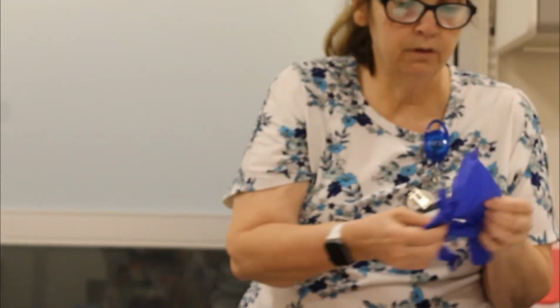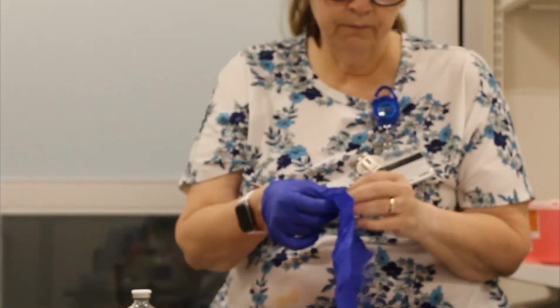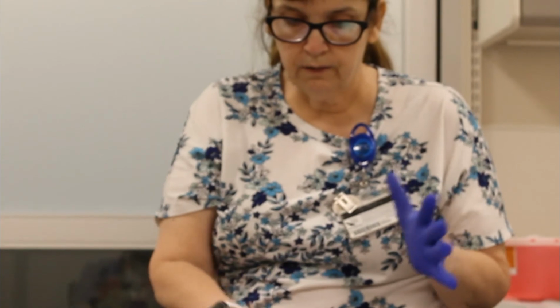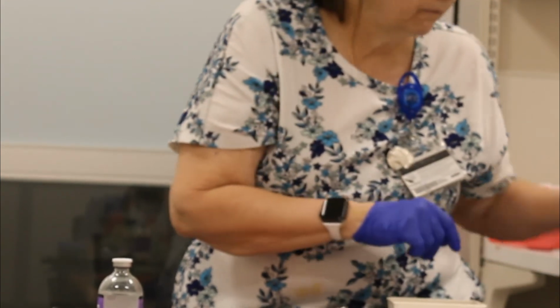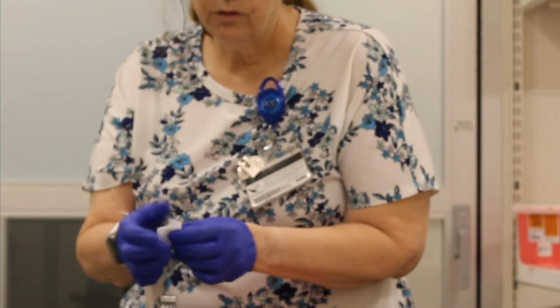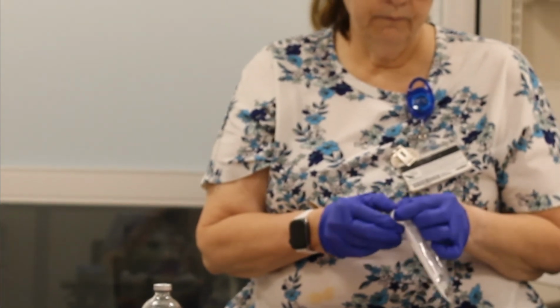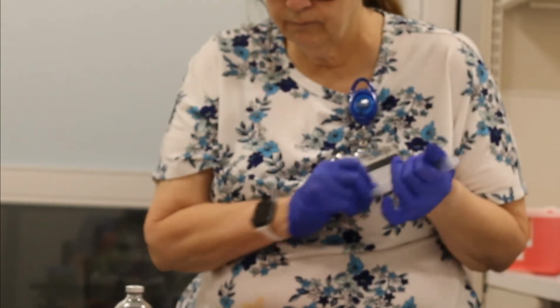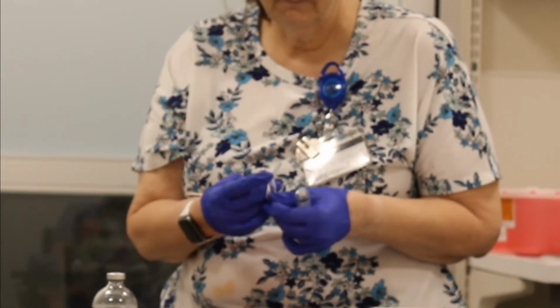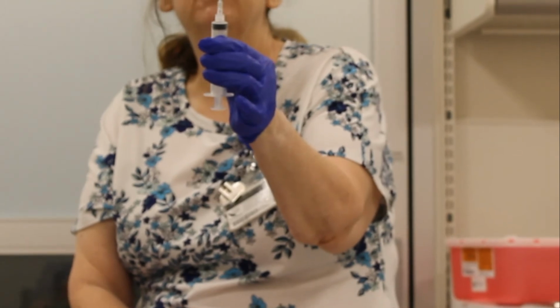Put on my gloves. Now, our blunt tip needles at HCC Hospital are the ones with a green stripe. So I'm going to clean my top. I have a 10 mL syringe. Now, that's my blunt tip needle.